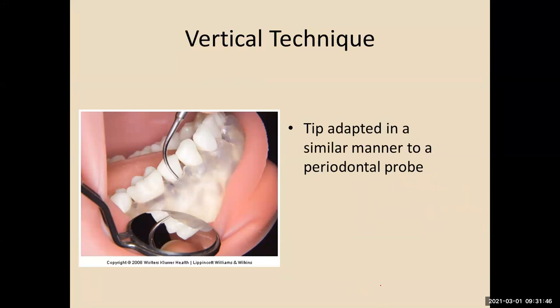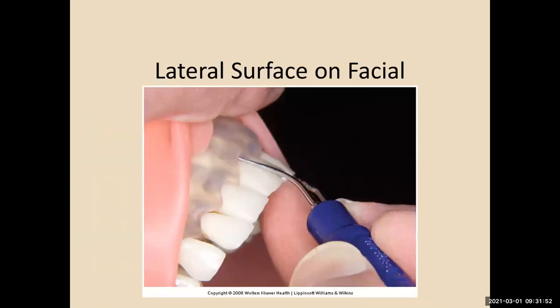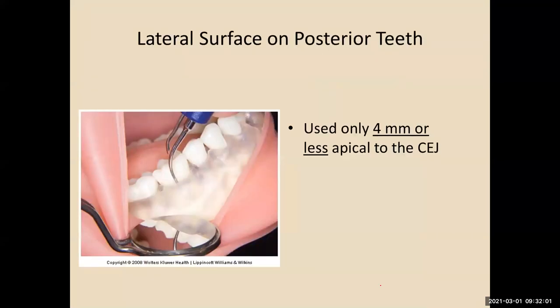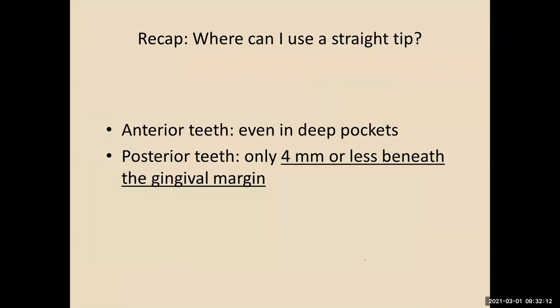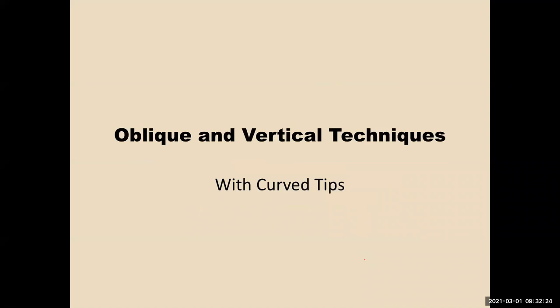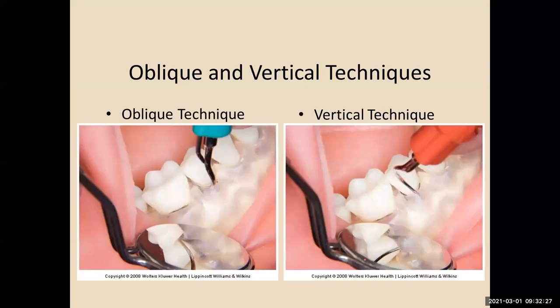Vertical positions are great for the facial and lingual surfaces, straight up and down. The universal or straight tip is used for 4 millimeters or less apical to the CEJ, and anterior. You can use oblique or vertical strokes. Then we have our curved tips.